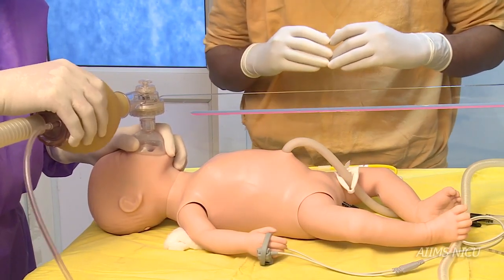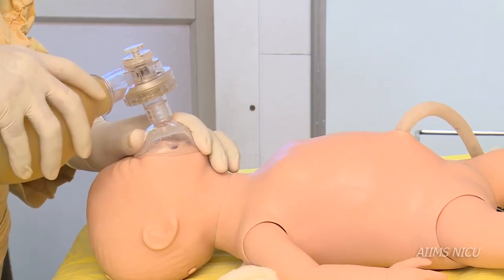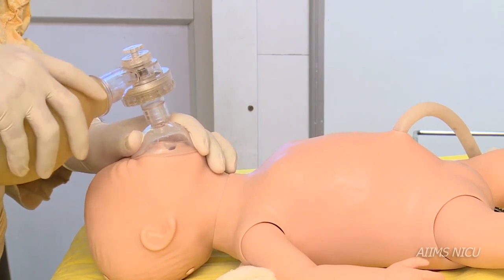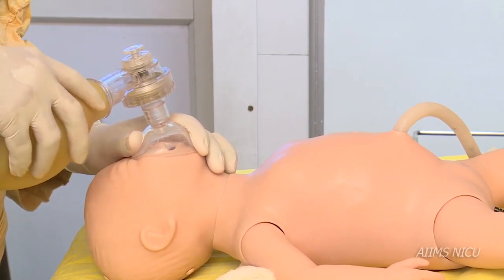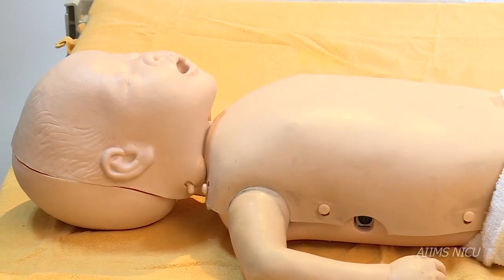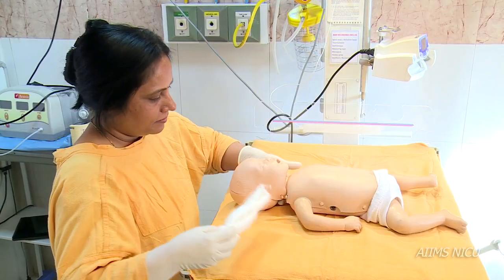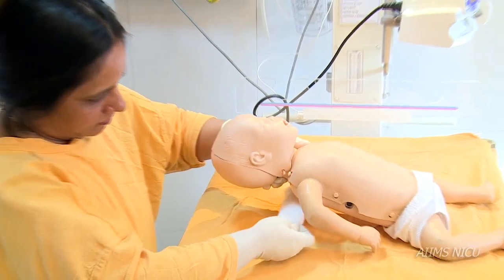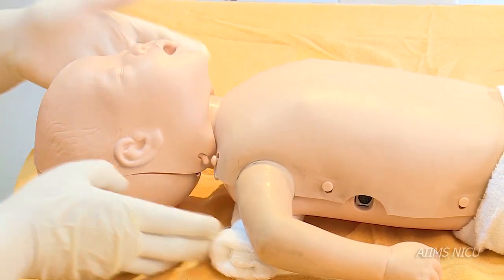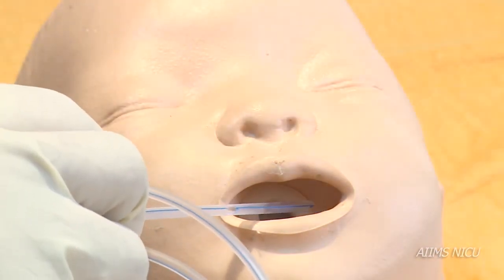Before starting bag and mask ventilation, ensure that you stand at the head end or the side of the neonate so that you can appreciate chest rise. Ensure that the baby's head is placed in the sniffing position, which can be achieved by placing a shoulder roll underneath. Also ensure that the airway is cleared of secretions.